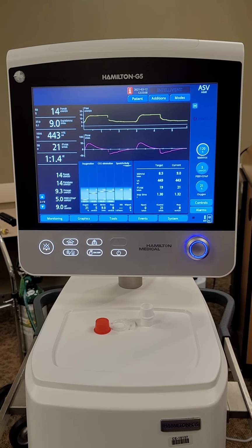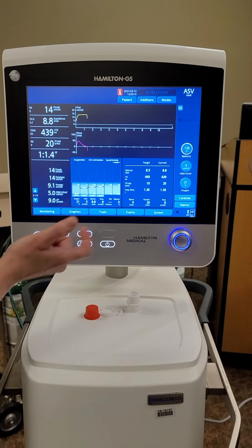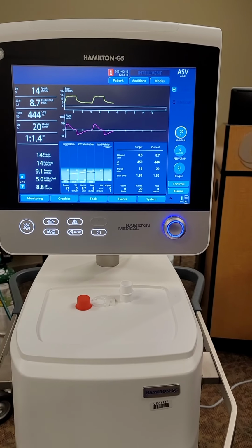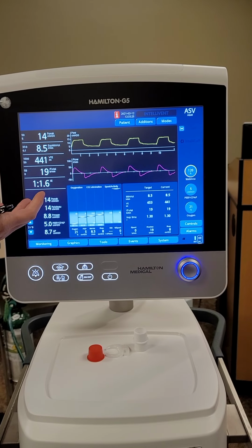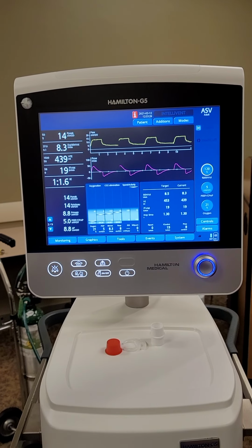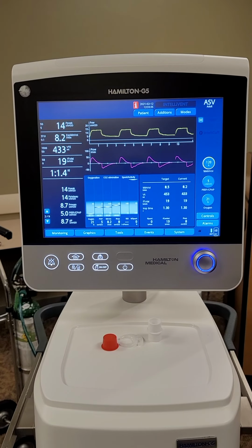They were retaining, but they were just miserable, and you were either going to have to sedate them or put them on ASV, and then you would just dial up your percentage to go above that minute ventilation to help meet their demand and get that CO2 down. Yep. Okay. So maybe the minute ventilation could not be doing the job, but they look miserable. Switch them to ASV, crank it up even higher.